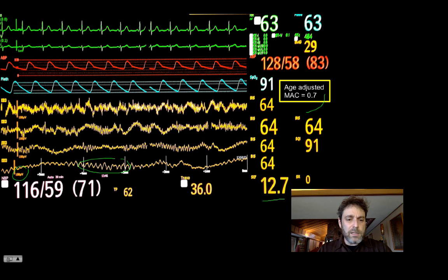You can really see these beautiful big delta waves. This is a nice place where they're appreciated. Over there to over there. So remember, I said this is 1 second, this is 2 seconds, this is 4 seconds. So if you have 2 and 4 seconds, it's a frequency of half a hertz. So we've got half a hertz delta waves and alpha spindles at about 10 hertz. This to me looks very consistent with adequate general anesthesia.